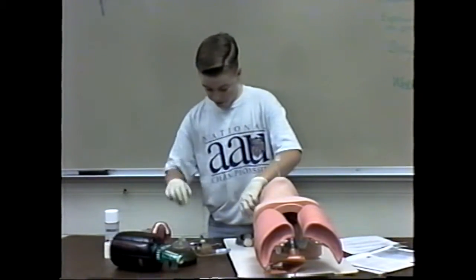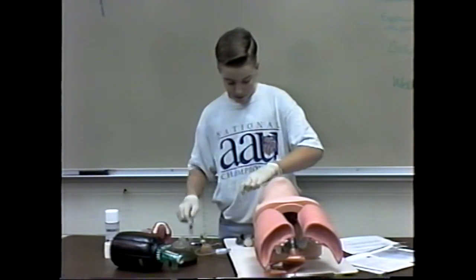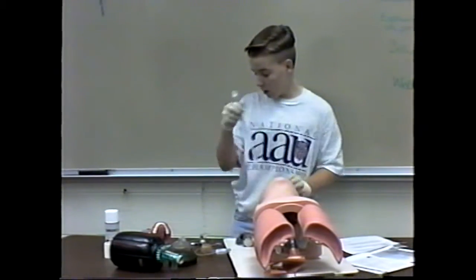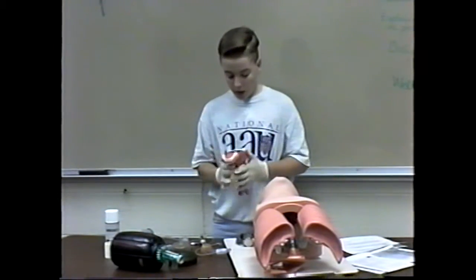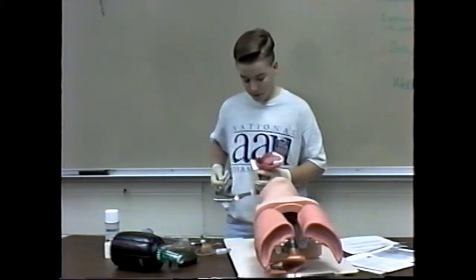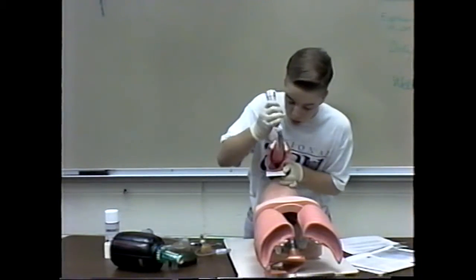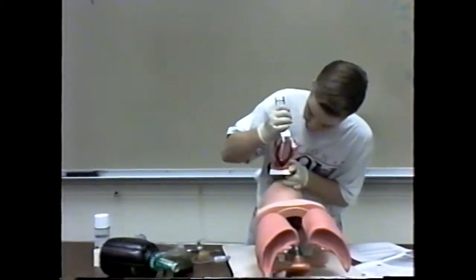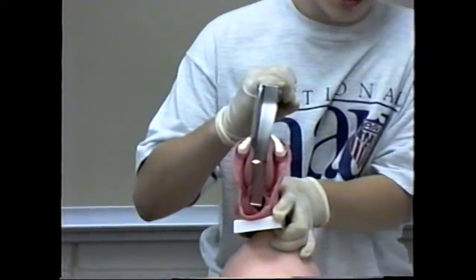What I did there was, on this part right here, all I did was take the laryngoscope to the right side and lift up to the left so you can see the vocal cords.